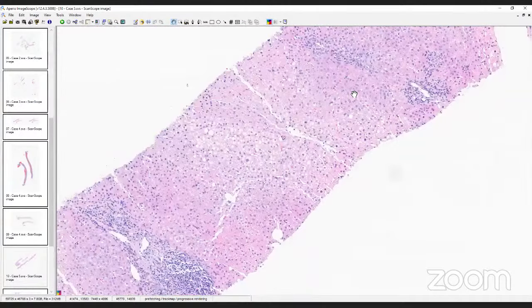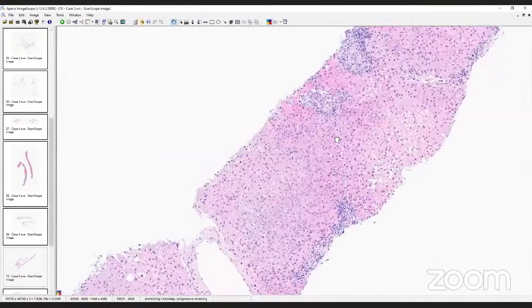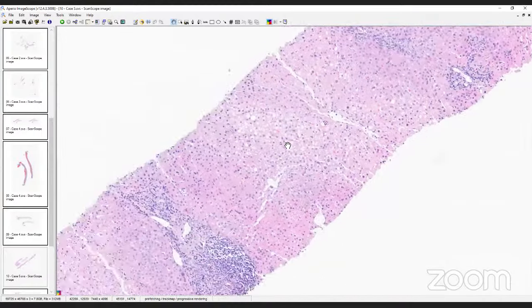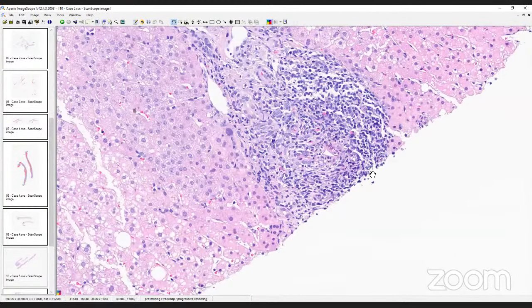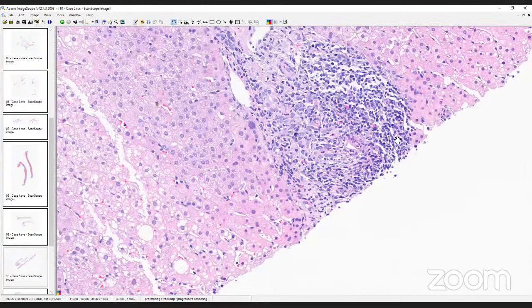And the other thing as we go through is that there is a little bit of fat. And I'm pointing that out because when you see the history, you'll realize why. And then here is the star bile duct, the one that almost gives the diagnosis away. So here's a bile duct, which is infiltrated by cells. And these are neutrophils as well as lymphocytes. And then you have this lymphoid aggregate, which seems to be attacking specifically the bile duct. It's not really interested in the hepatocytes outside. It's centered on the bile ducts. And you notice a few eosinophils as well in this portal tract.